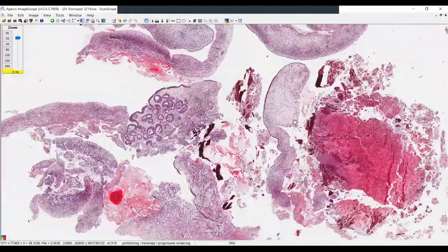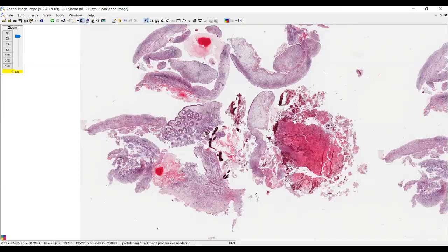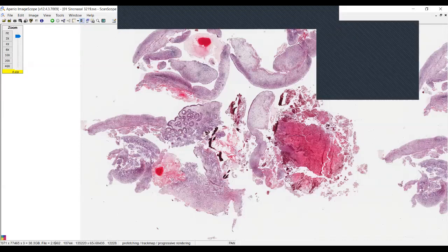So ultimately, my diagnosis for this case, because of the multitudinal nature of what is present, in order, is the allergic fungal sinusitis, because they need to manage that, the inflammatory polyps, because that can be a clinically recurrent lesion, especially with the eosinophil predominant inflammatory component, and then finally the respiratory epithelial adenomatoid hamartoma, because that really does not make a whole lot of difference in the management of this case at that time.